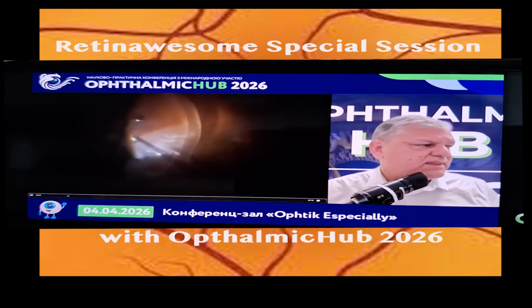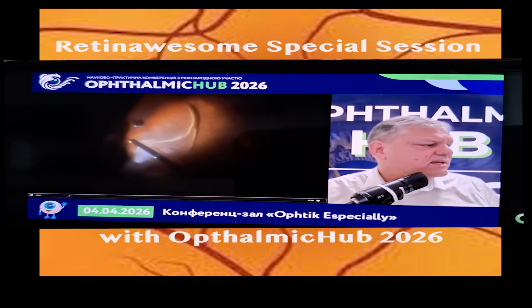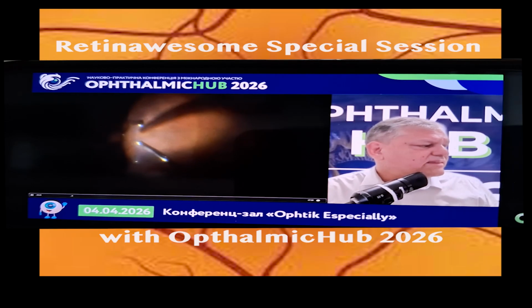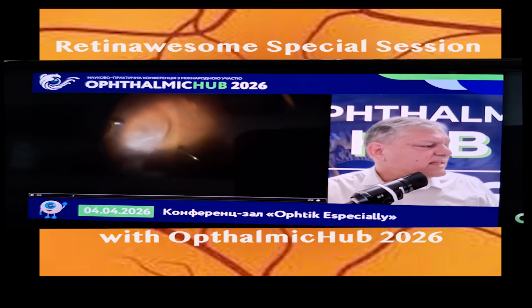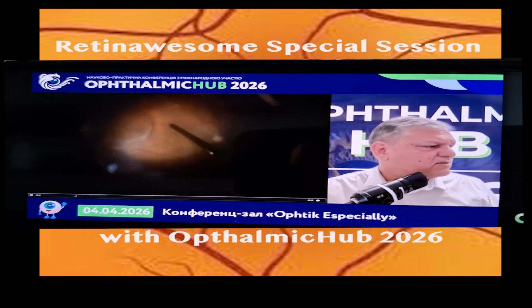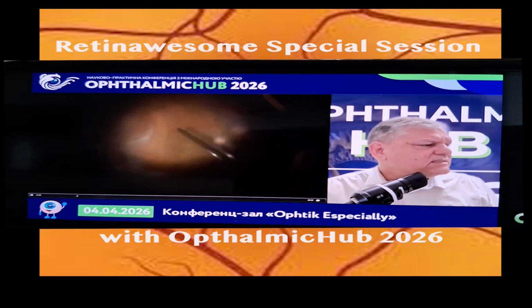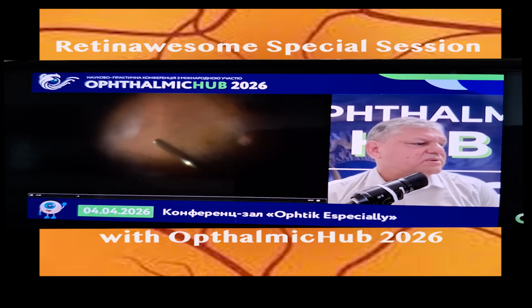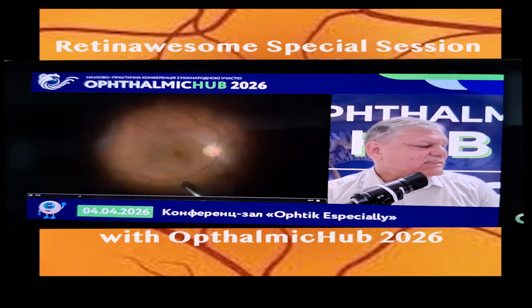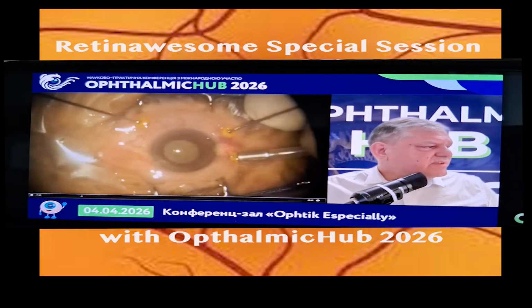You have this bullous retinal detachment, and the macula was partially on. If you pay attention, there is a demarcation line that doesn't allow the fluid to go and detach the retina. That's why I started with a very peripheral retinotomy in order to relieve and squirt subretinal fluid out of the subretinal space.